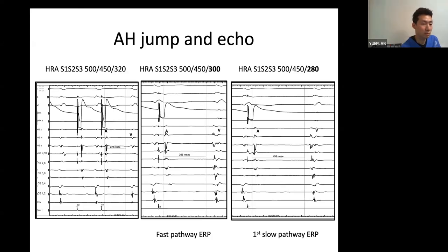But this AVNRT is still a very enigmatic animal for us. We do so many of these, and still don't understand the complete tachycardia circuit. We know where the exit site is. We know what the junction is, and what the slow pathway potential is. But between the leftward and rightward extensions, where they turn around, nobody knows yet. We haven't been able to map that pyramidal space because we don't have a means to do that yet. Okay? Did I answer your question?